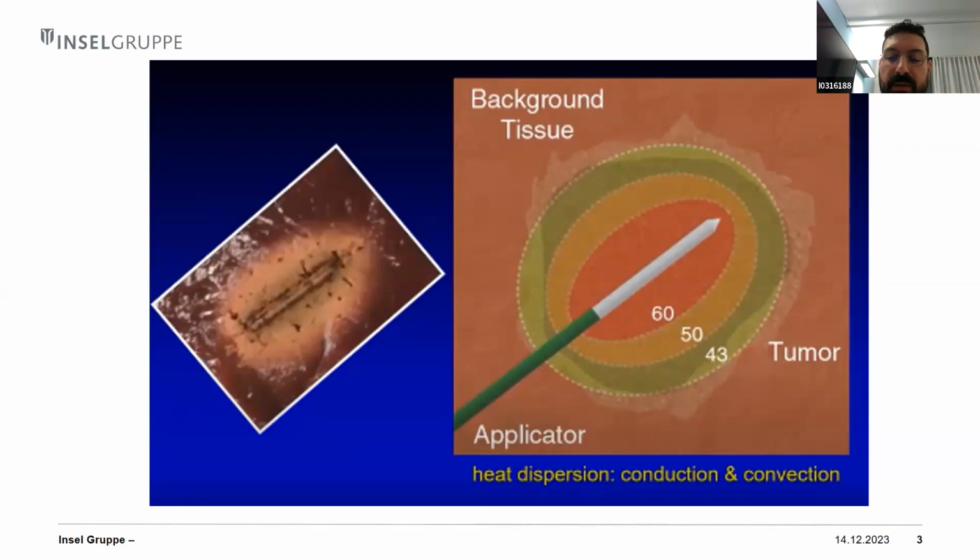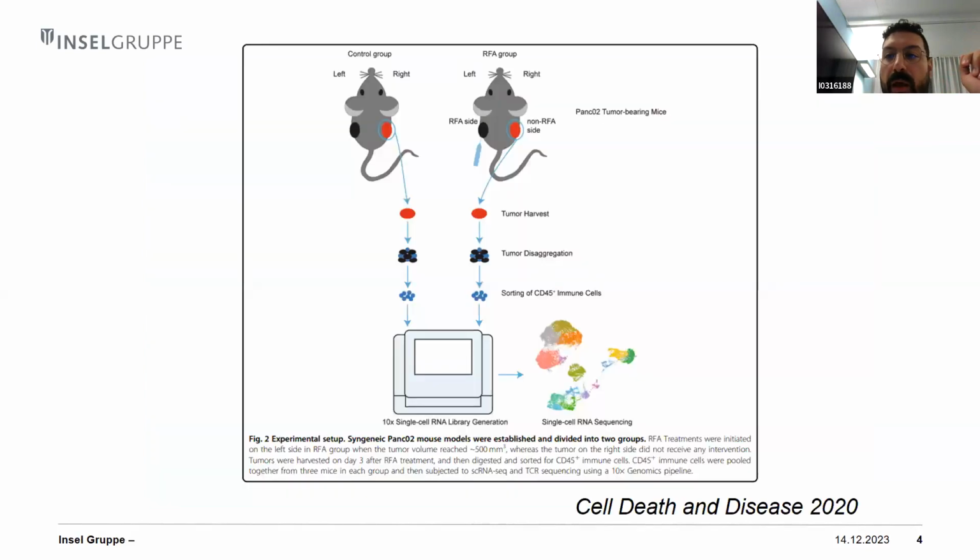Temperature greater than 100 degrees Celsius is less effective, as ablation at this temperature causes water to become vapor and burn the tissue, resulting in an increased tissue impedance but a decrease in efficacy. RFA is also believed to have immunomodulatory effects. It is postulated that the systemic immune response from the release of tumor-related antigens in RFA could contribute to a durable oncologic response.